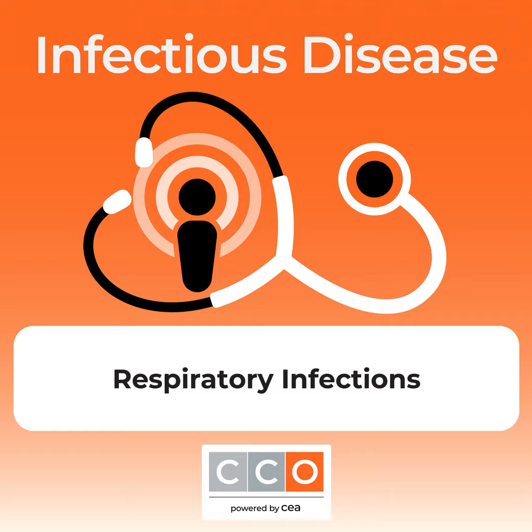And so let's look at pathogen detection rates. And you can see for organisms that are common causes of hospital-acquired pneumonia, like Staph aureus, Pseudomonas, E. coli, Klebsiella pneumoniae, that actually the detection rate in the FilmArray pneumonia panel was quite similar to the detection rate using culture. But where the FilmArray pneumonia panel really increases your yield is with some of your community-acquired pathogens, many of which are more fastidious, like, for example, Strep pneumoniae or pneumococcus, Haemophilus influenzae. And of course, the other big improvement with the lower respiratory tract infection panel, the pneumonia panel, is speed, where it took 29 to 42 hours to identify a pathogen in culture here. Here with a pneumonia panel, you're detecting that within 2 hours.